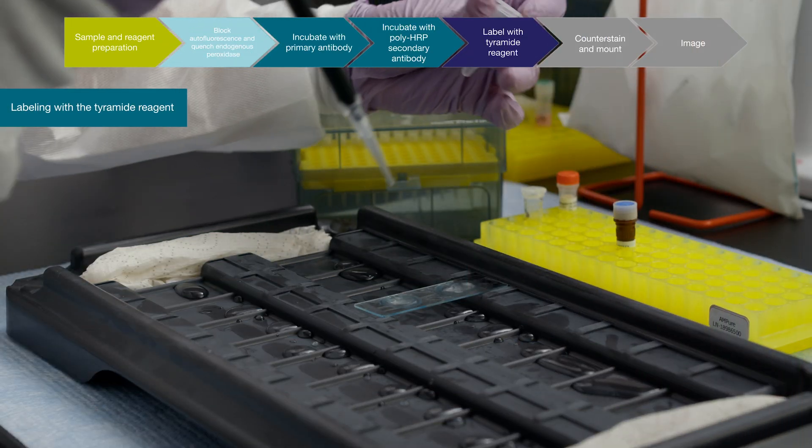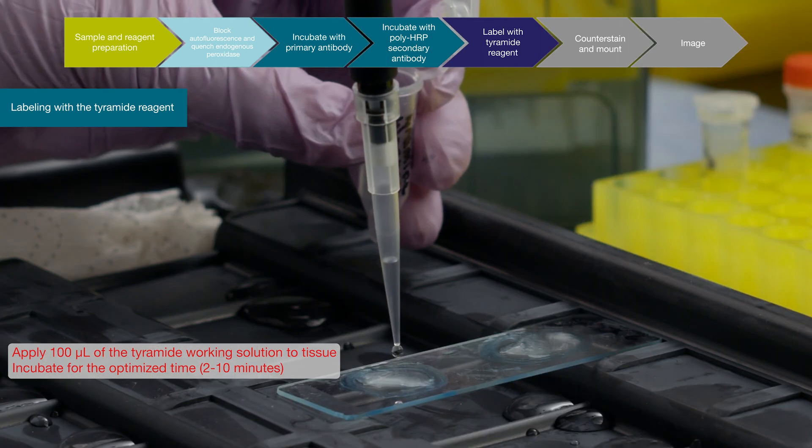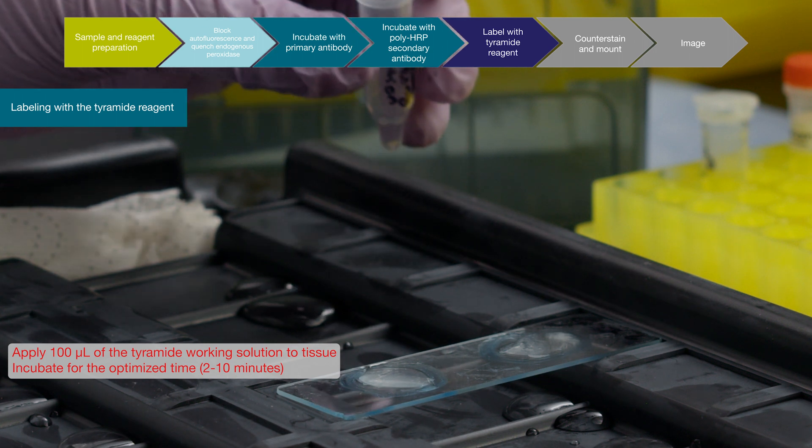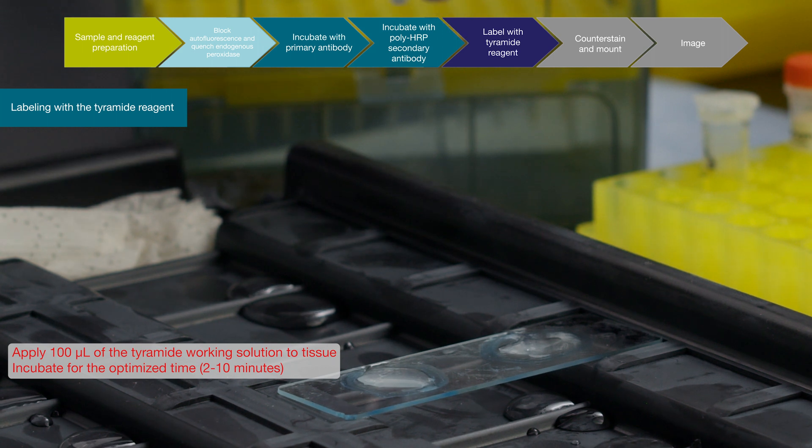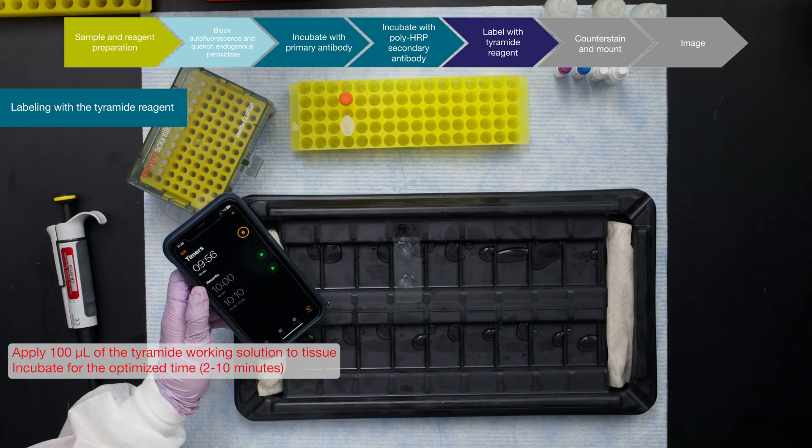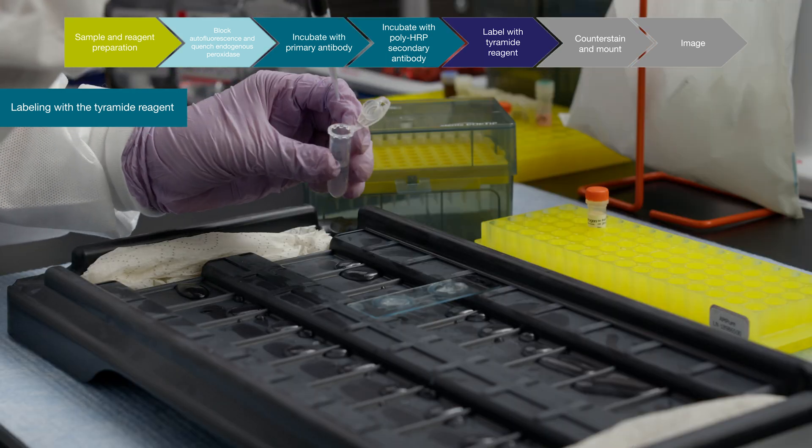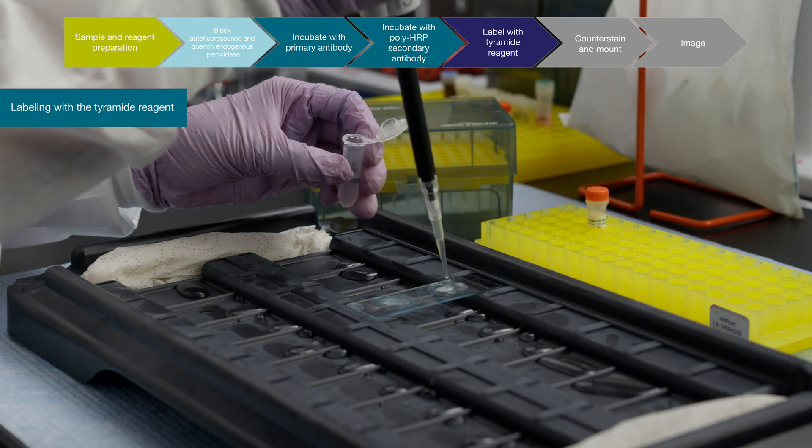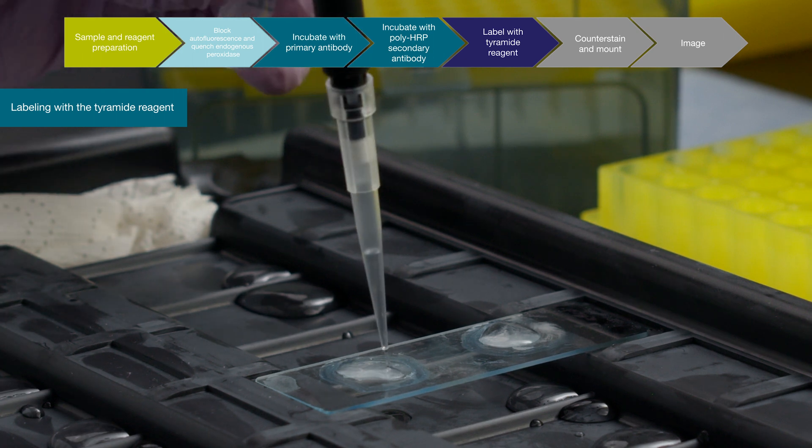Label with Tyramide reagent. If multiplexing, the heat-induced epitope retrieval step can be repeated to stop the reaction before proceeding with the next primary antibody incubation. If using only one primary antibody, use the STOP reagent. Apply the working STOP solution to stop the reaction. Having too much antibody, or not stopping the depositing of the Tyramide dye, will result in overstaining the sample.